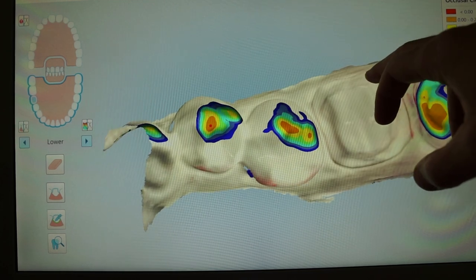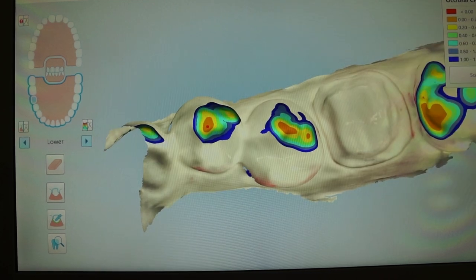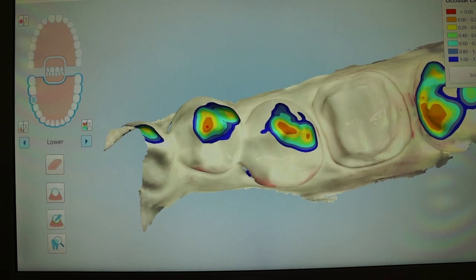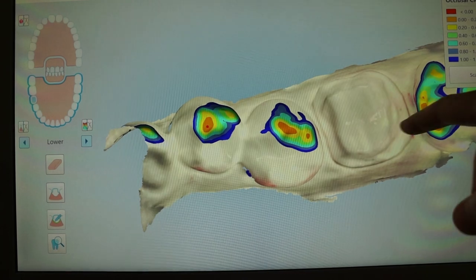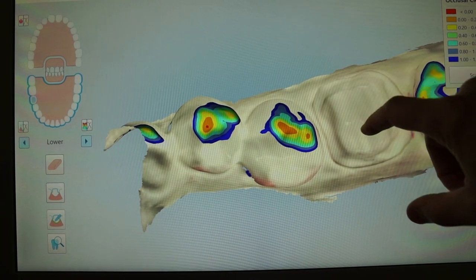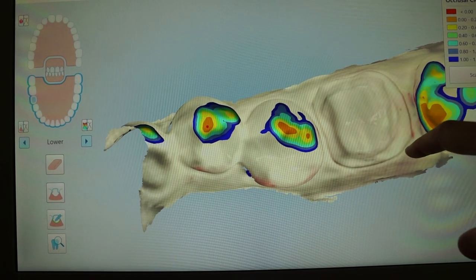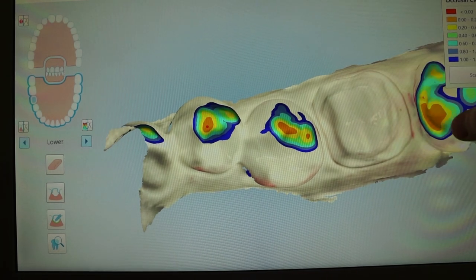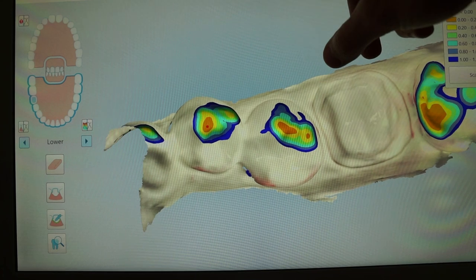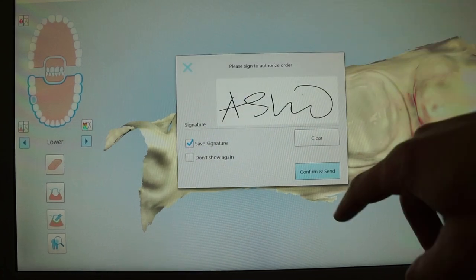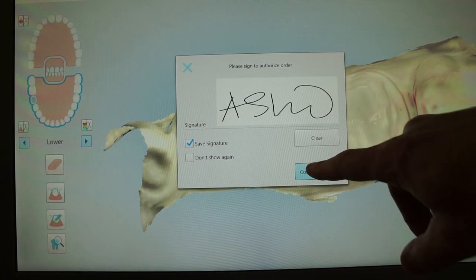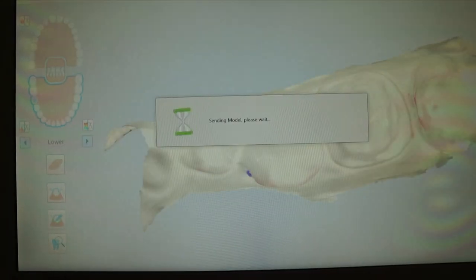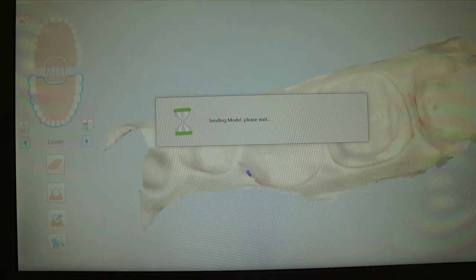I like to put it at the lowest scale. I generally do bonded Emax, which means that I only need about a millimeter of room between the prep and the opposing tooth. This helps me to evaluate my prep right off the bat. If I need to go back and scan after reducing a little bit more, I can do that.